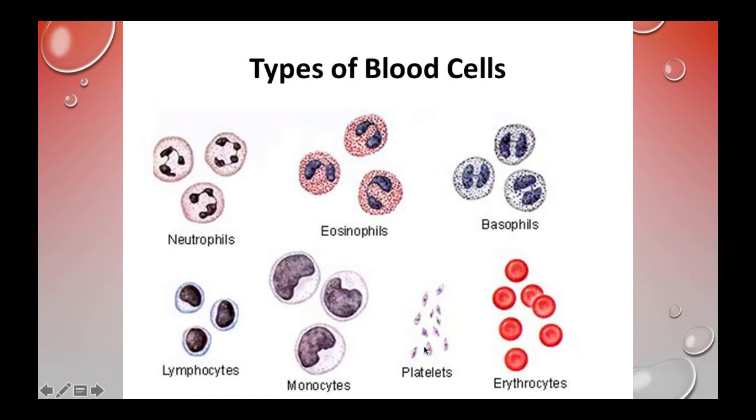And platelets are these little fragments of cells, right? They're small cytoplasmic fragments. And their function is, of course, in hemostasis or clotting. And you're going to see you can have quite a few of them because they're quite small. They're just fragments, and you can have 130,000 to 360,000 per millimeter cubed.